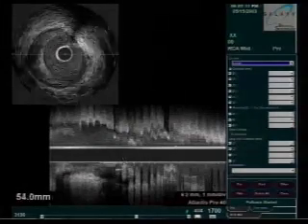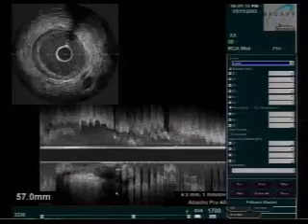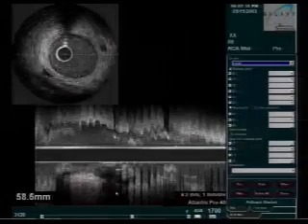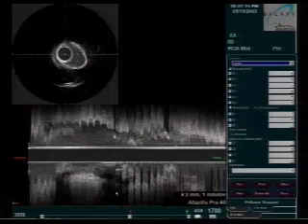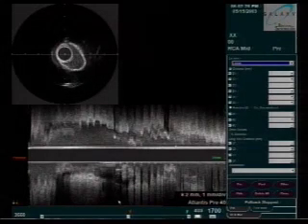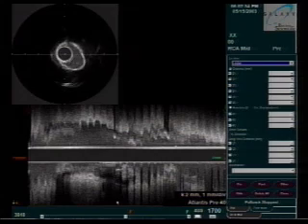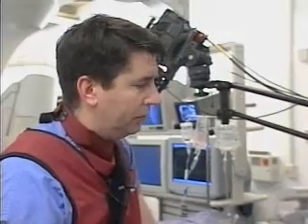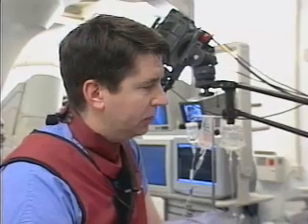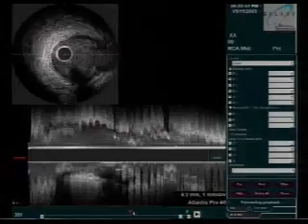It's always remarkable to me, Mike, and to people who have been doing intravascular ultrasound, that even areas that look pretty darn good on the angiogram, they don't look blocked at all, have often quite a bit of atherosclerosis, as you just saw there. The top part of this fellow's artery didn't look too blocked, but we saw all that buildup material inside it. Exactly. Actually, in research studies, they did intravascular ultrasound on young healthy individuals in their 20s and 30s with no apparent atherosclerosis, and you can see some very silent atherosclerosis building up in the artery wall long before it's evident either clinically or on the typical angiogram.